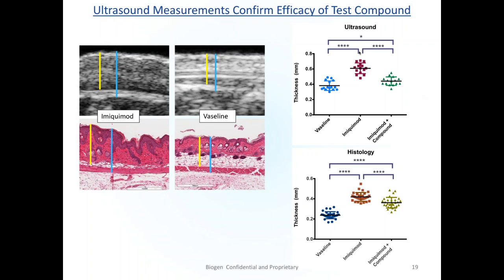For the 3 models I presented here, the features were apparent enough with the ultrasound that we could identify all the barred regions that we're doing the measurements on for each of the 3 models. So we had something to really focus on.